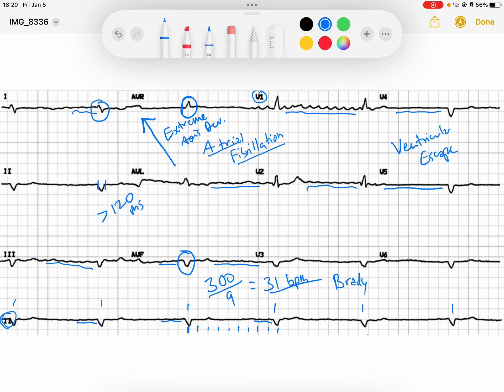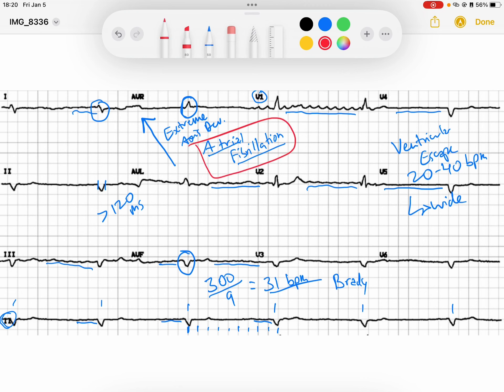We know that ventricular escape rhythms occur at a rate of roughly 20 to 40 beats per minute. We also know that these are wide because they do not take the His-Purkinje highway system from the AV node. Because what is occurring right now is this person has atrial fibrillation with a complete or third degree heart block. And how do I know that?